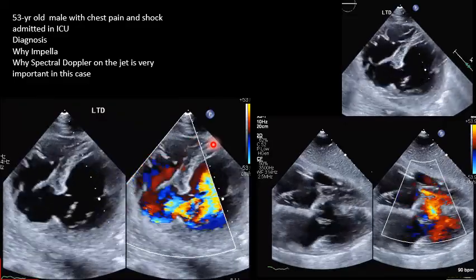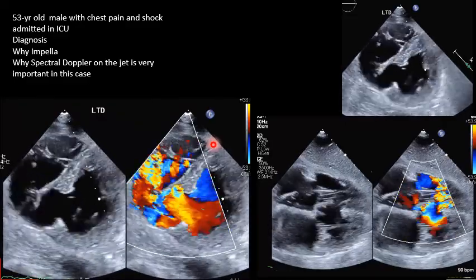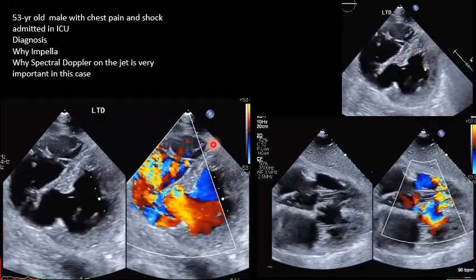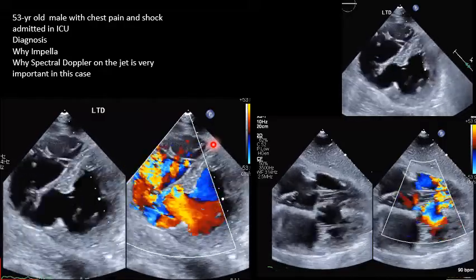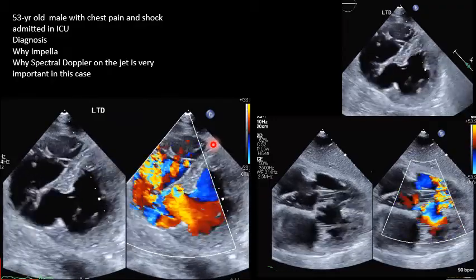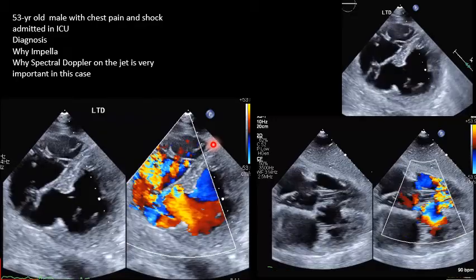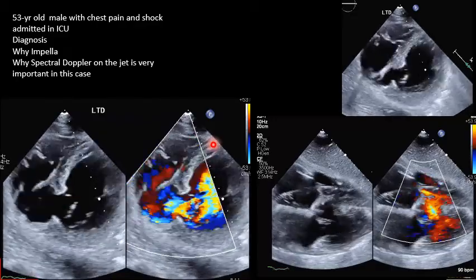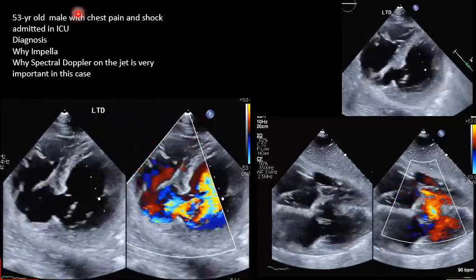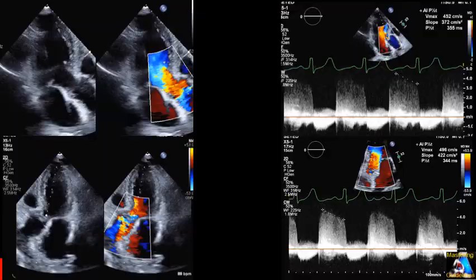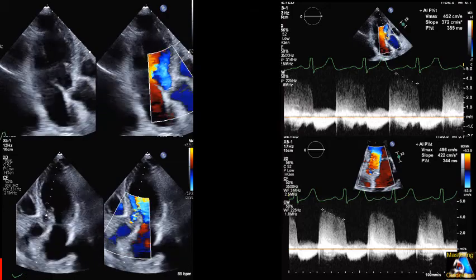There is a specific indication for this patient that needs Impella echocardiography daily. What is that indication? Third, why is the Doppler study — color Doppler and continuous wave Doppler — very important and critical on this case?